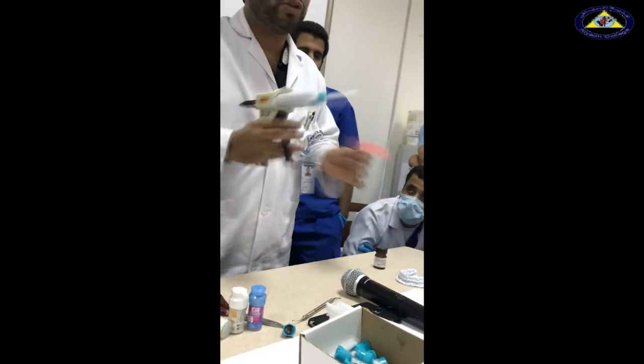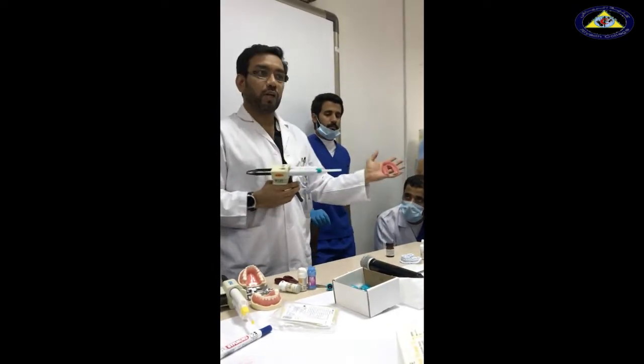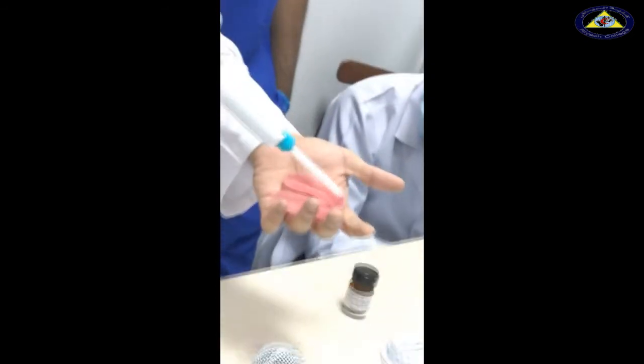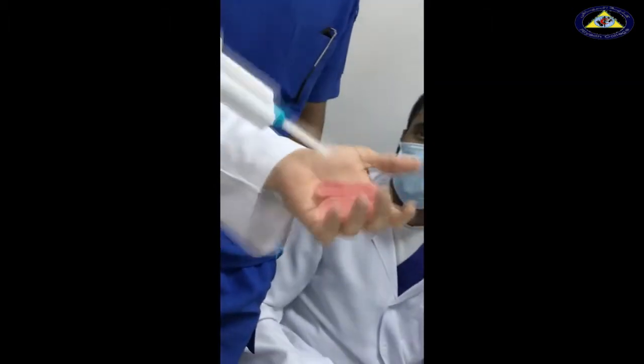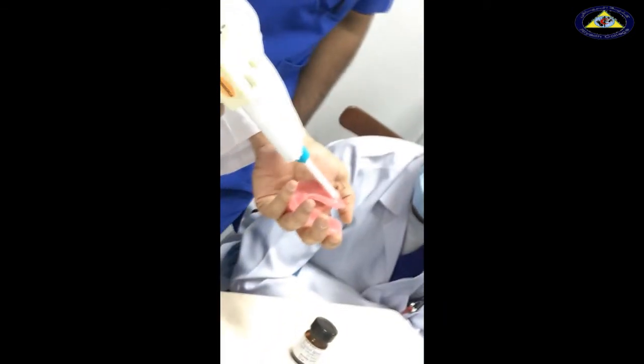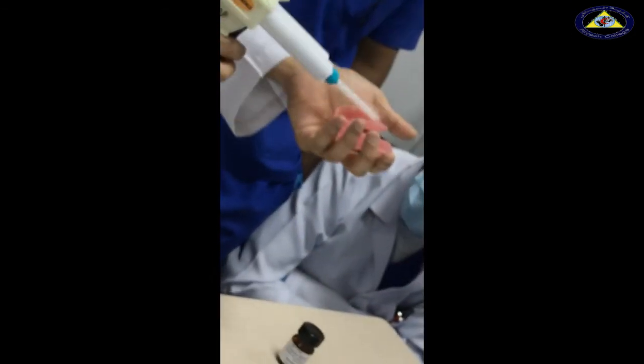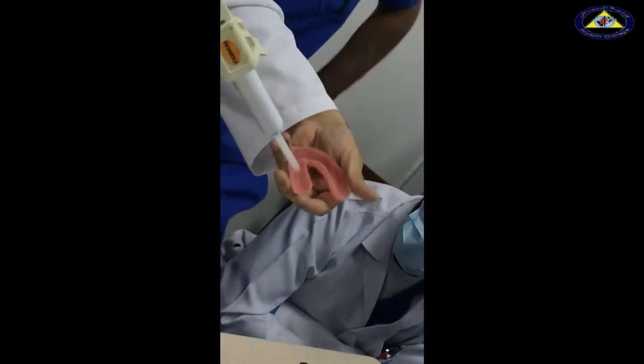By this time, your assistant will be loading the tray. Many times people hold the tray in a way that all the material gets stuck in one area and it becomes a big mess. It's much better to hold it differently so that the material does not coat unnecessary areas — no wastage, no mess. It comes all the way over evenly. I will show you how that's done.